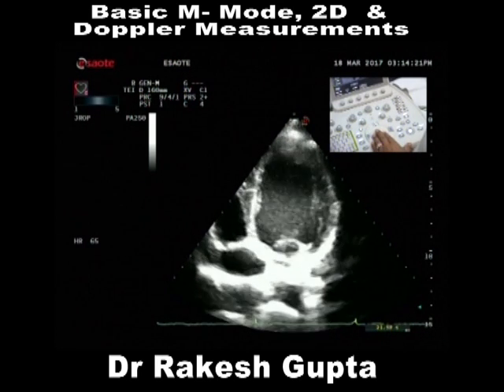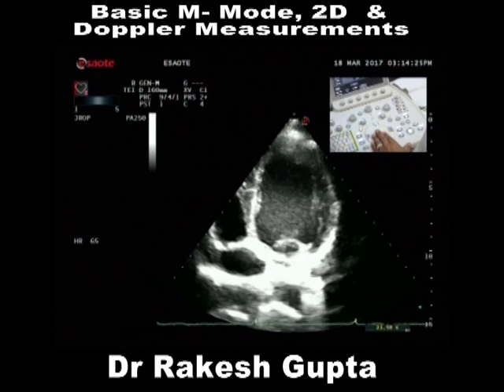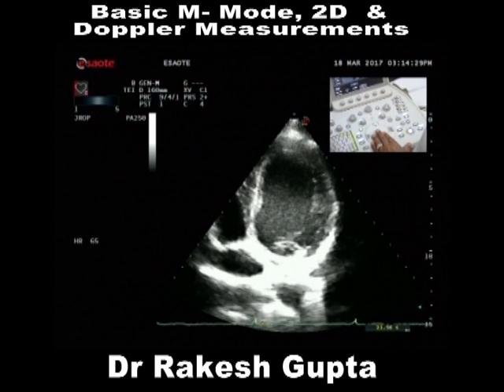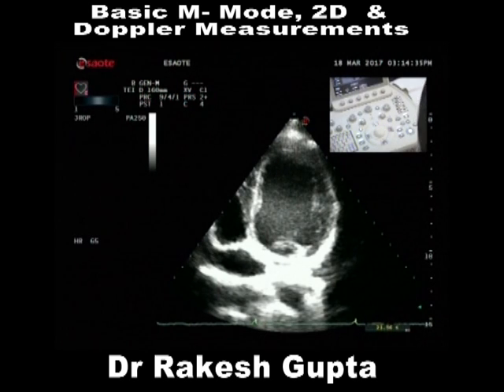I am going to move it for you. Correct? So when does the systole start? Beginning of QRS complex or later on? Beginning of QRS complex is over here, and LV has not contracted till this point.